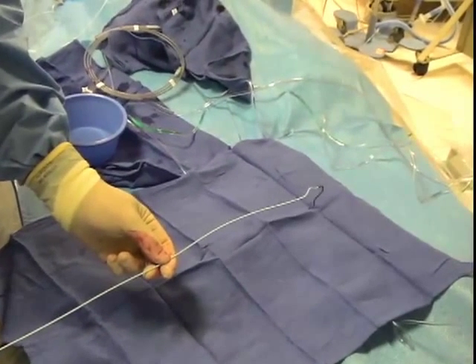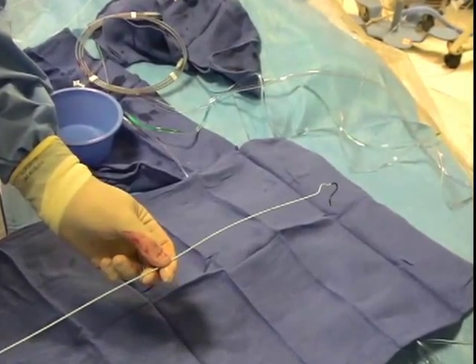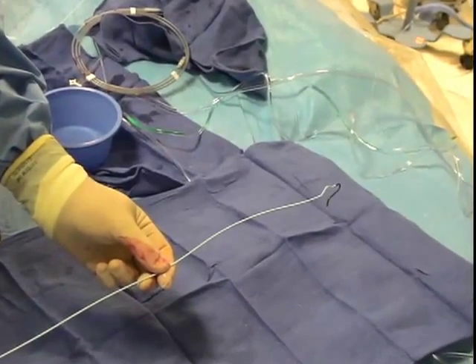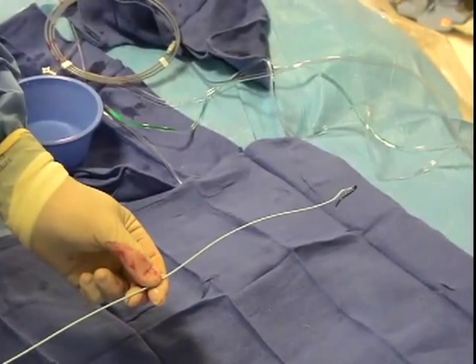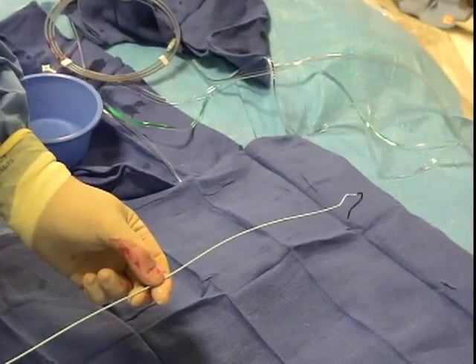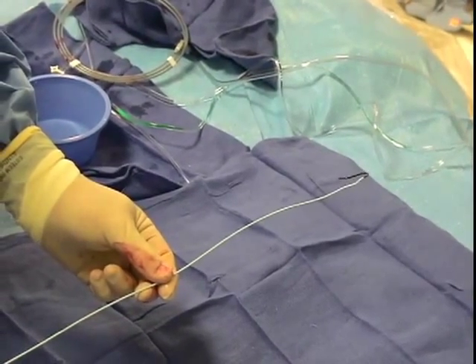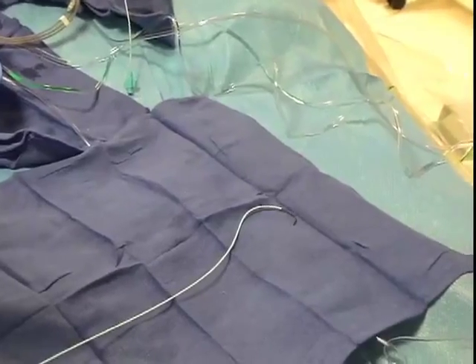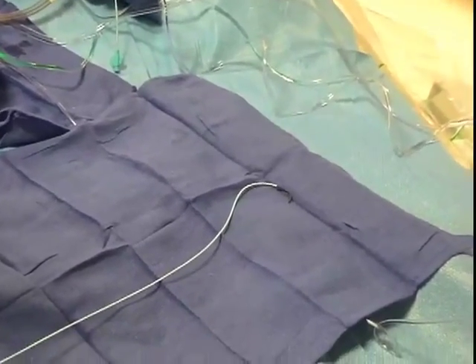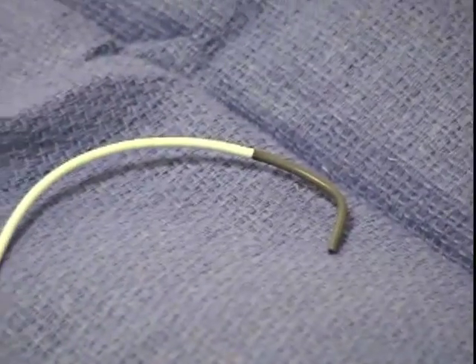Here we see a catheter called a Mickelson catheter. This will be inserted through the patient's right femoral artery into the descending aorta, and the tip of the catheter — the black portion — will be used to select and inject different blood vessels by the spinal cord.